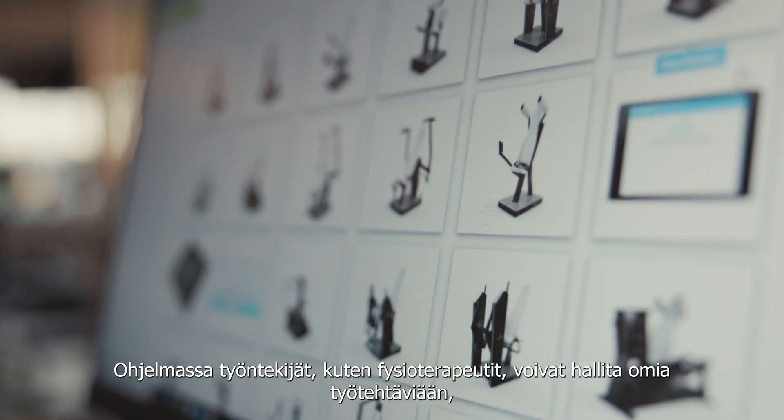HerSmartTouch enables you to conduct multi-site studies in a consistent manner. You can monitor exercise adherence and generate reports for each and every training session. You can also compile reports on the progress of the group or a single customer, which makes HerSmartTouch an excellent solution for research purposes.